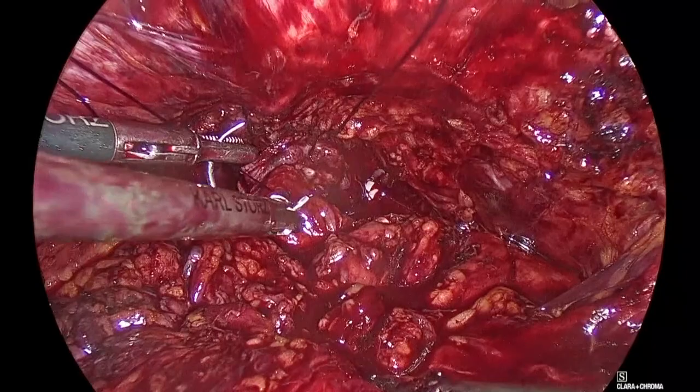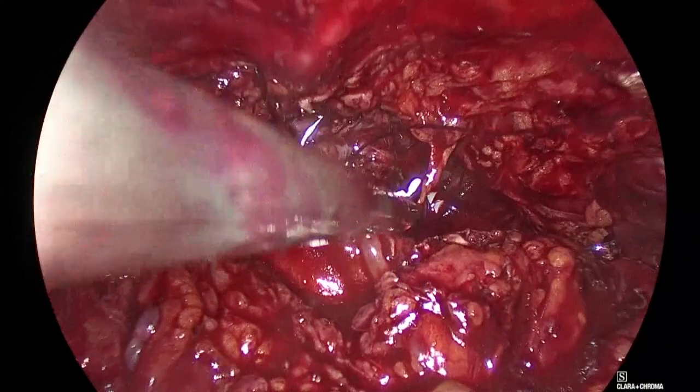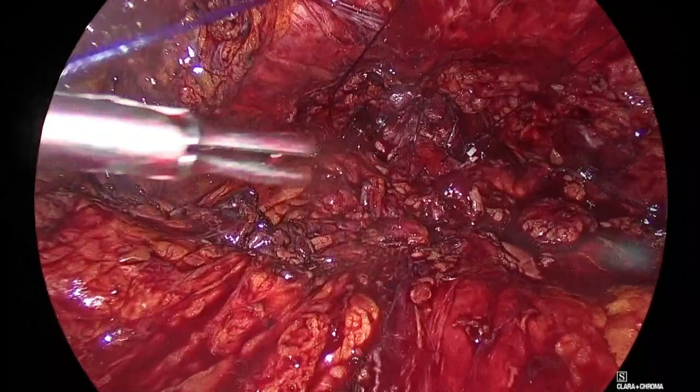Good. Come in. Show me, Padeli. Back. Go back, Padeli. Good. I always find it difficult to get a material for a Rocco stitch in the lap surgery, until I learned robotic. The four-o monocryl is beautiful. If you use a V-lock, it's not difficult. You can use a V-lock for a Rocco stitch. I used to do it in the beginning.